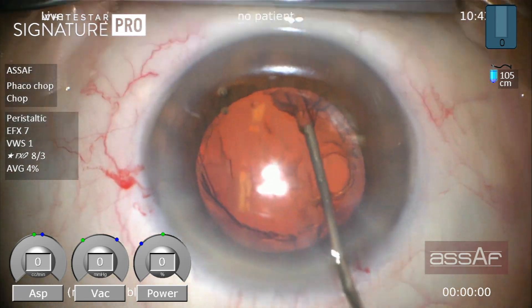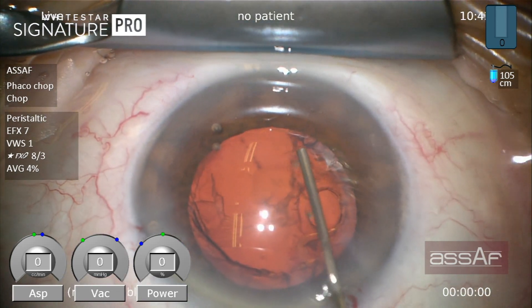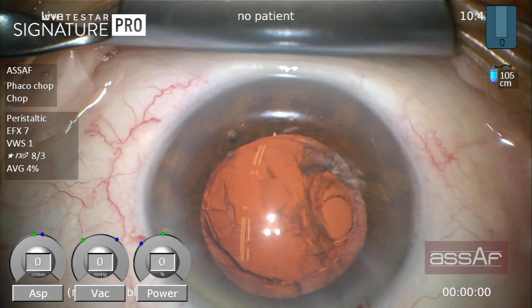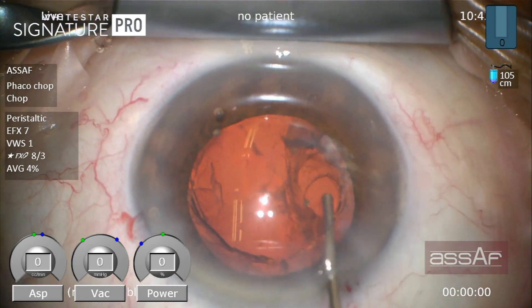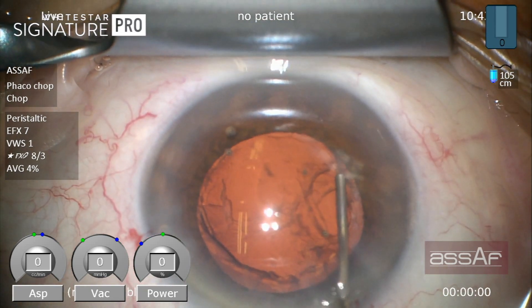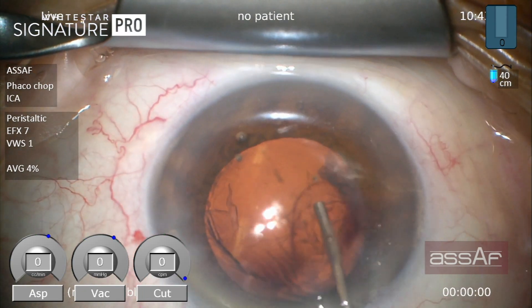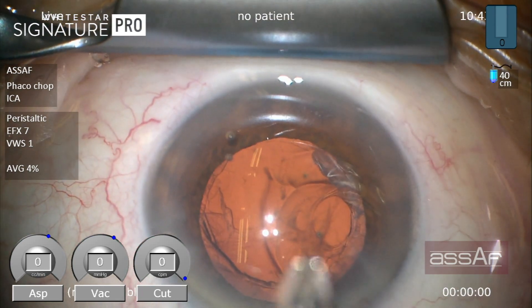Conventional irrigation-aspiration will cause disturbance inside the anterior chamber and would hydrate the vitreous, increasing the vitreous volume — this would invite more vitreous to prolapse inside the anterior chamber and complicate the surgery. So I decided to move forward with manual aspiration of the remaining cortical fibers, and every now and then I have to inject OVD to tamponade the vitreous.